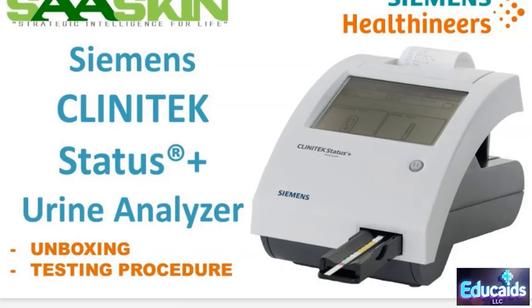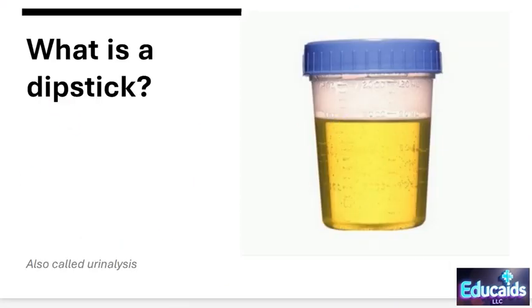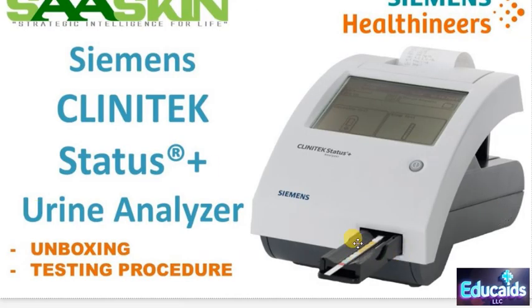A lot of clinics and obviously in the hospital, they have what is called a urinalysis machine. And so you will take your sample. We would bring the sample over to the lab, obviously with the label on the sample, and then the lab would take a strip and dip it in the urine, blot it off, and they would place it in this machine, and they would hit this button right up here where it says strip test.